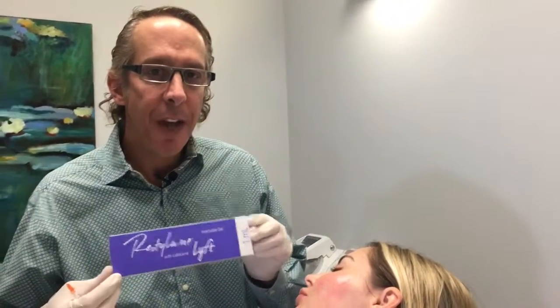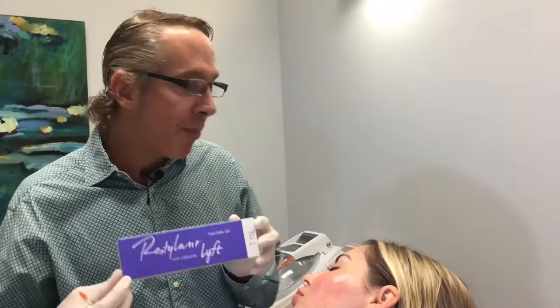Hi, it's Dr. Steve Weiner. I'm going to show you how to do lift to the cheeks. Lift is a great product because it has a very high G prime, so it's really good for the cheeks.